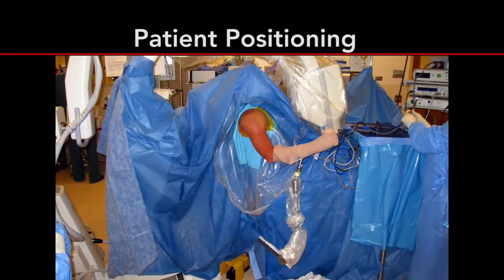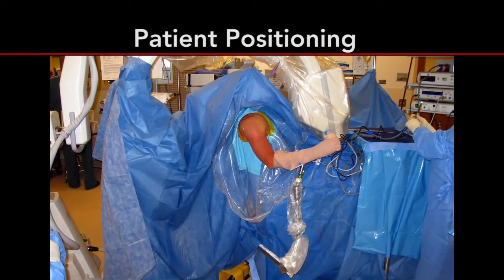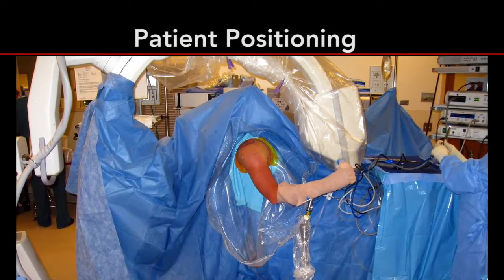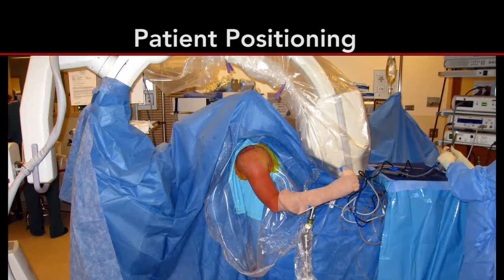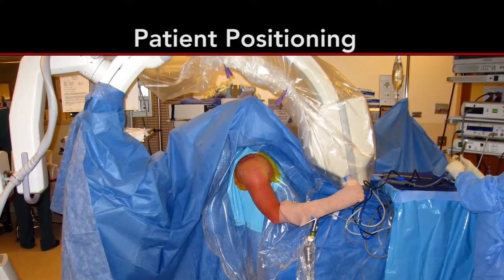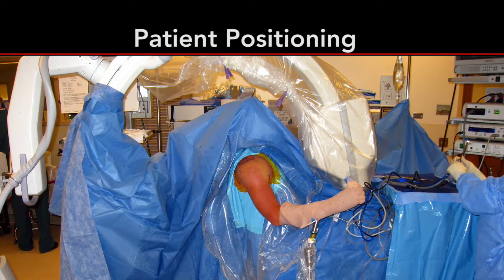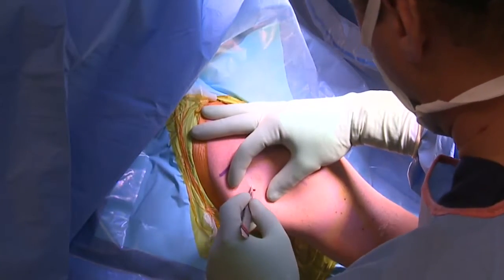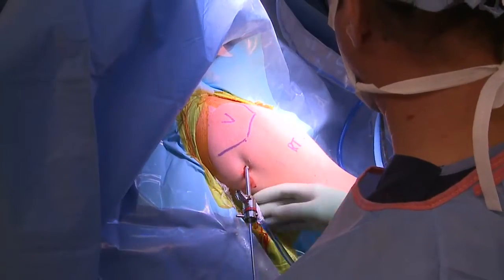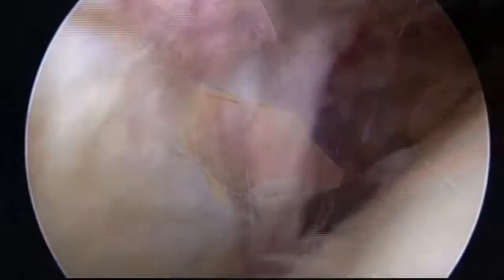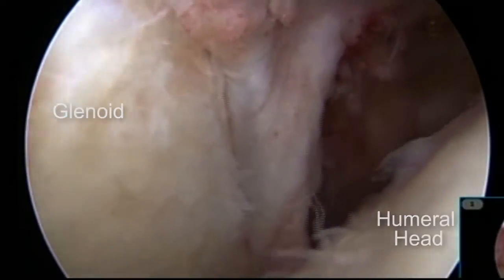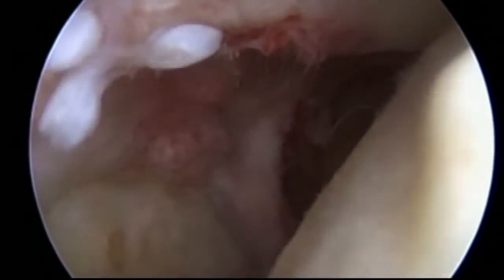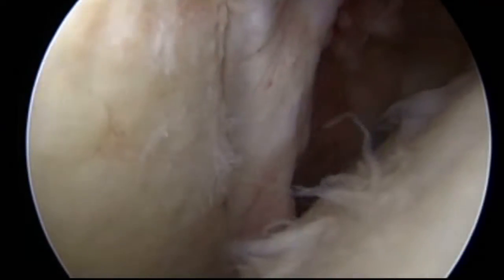The patient is placed in the beach chair position with a pneumatic arm holder. A fluoroscopic C-arm is draped into the surgical field for visualization and to aid in resection of the inferior humeral osteophyte. After establishing the standard posterior and anterior superior portals, diagnostic arthroscopy is performed, confirming end-stage osteoarthritis with degeneration of the labrum and synovitis.